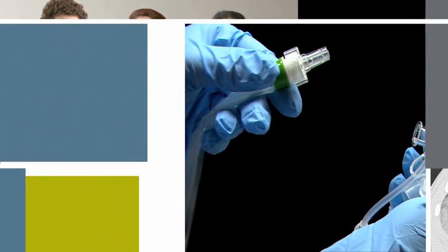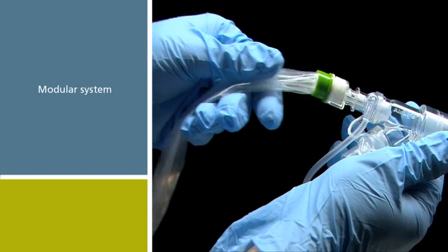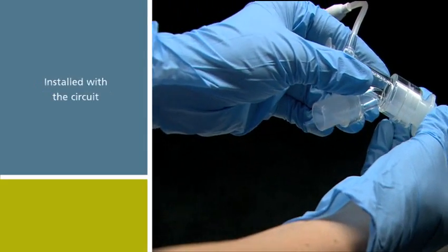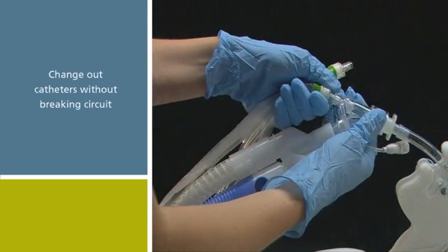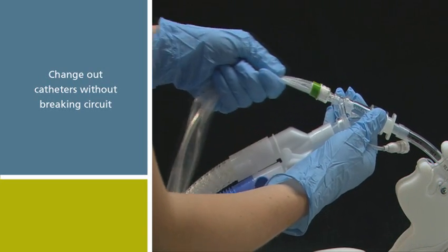The AIRLIFE closed suction system is different from traditional closed suction catheters because it is modular. The Verso adapter is installed when setting up the ventilator circuit, which means you can perform closed suction catheter changeouts and various airway access procedures through a single port without ever breaking the circuit.